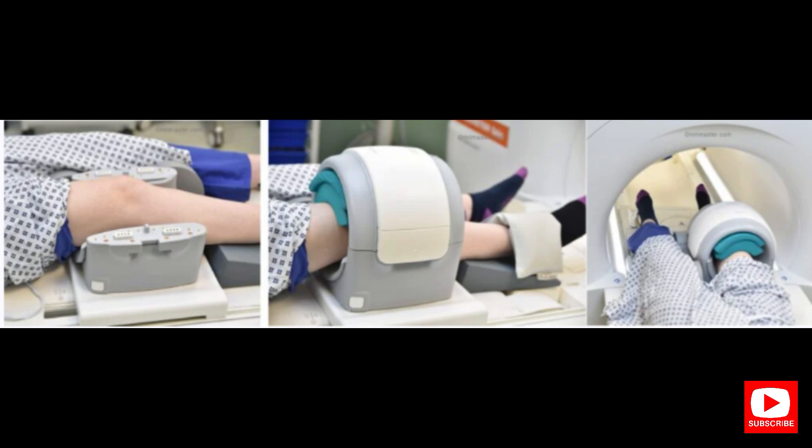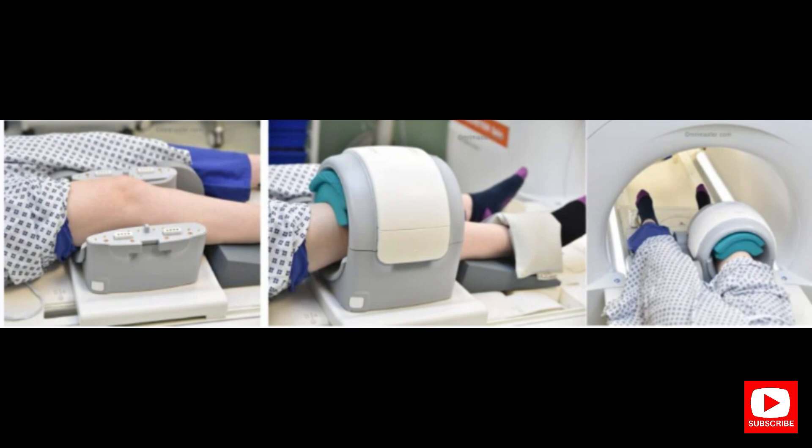First, position the patient feet-first supine and place the knee joint on the knee coil and align the landmarks. Set the knee coil gently and support the knee joint so that the knee cannot move. Center the laser light on the midpoint of the knee coil.